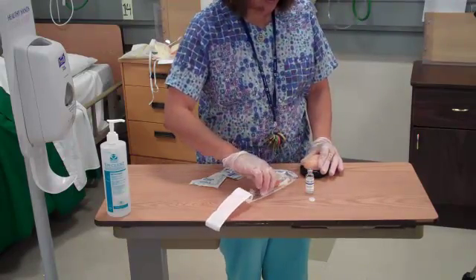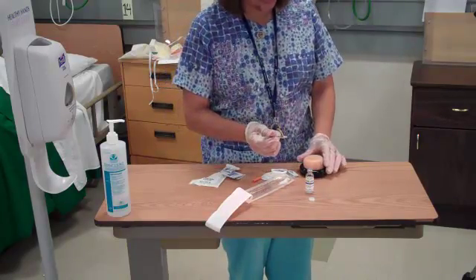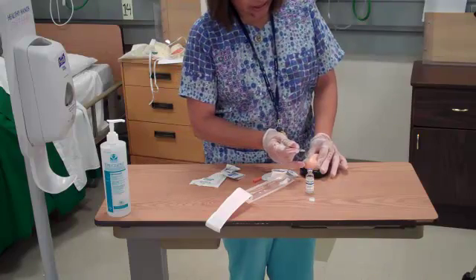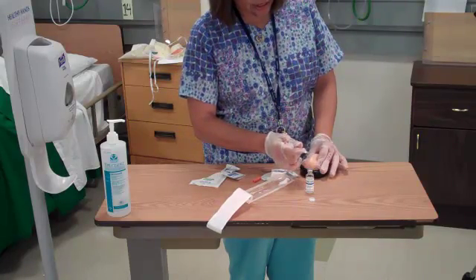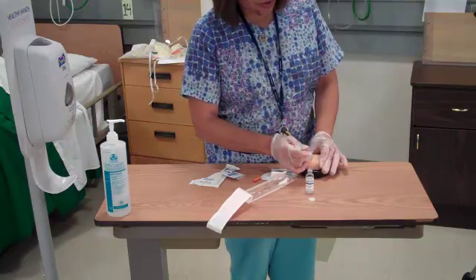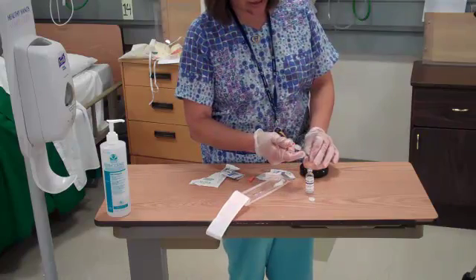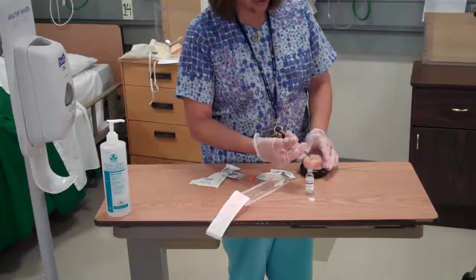Go ahead and pick up my syringe, take the cap off, hold the syringe like a dart, elevate the subcutaneous tissue, inject the needle at a 45 degree angle, support the hub of the needle of the syringe with my hand, and press in the plunger to administer the medication.